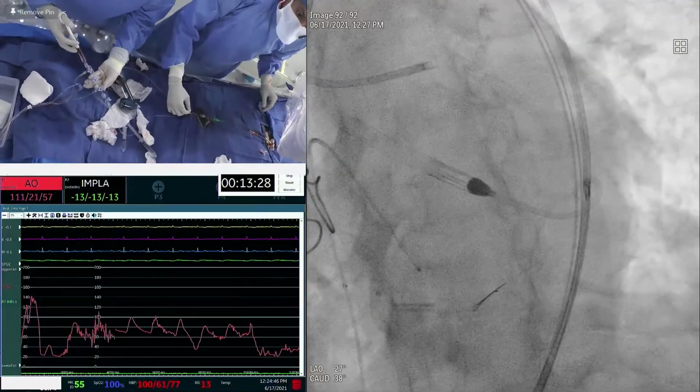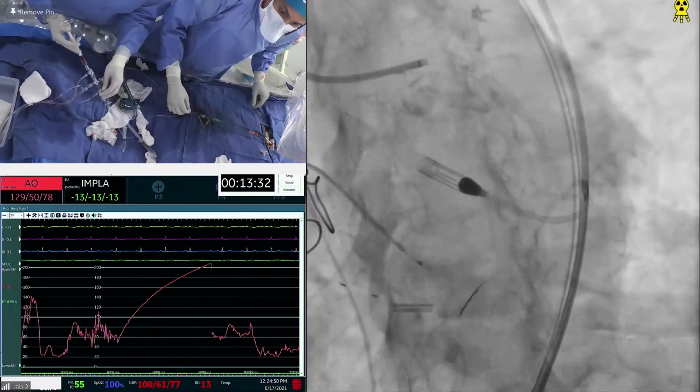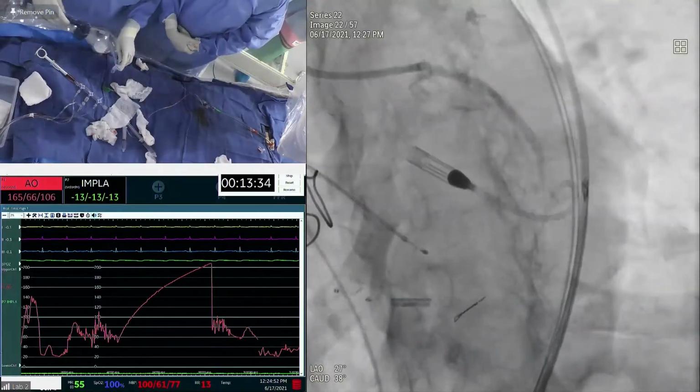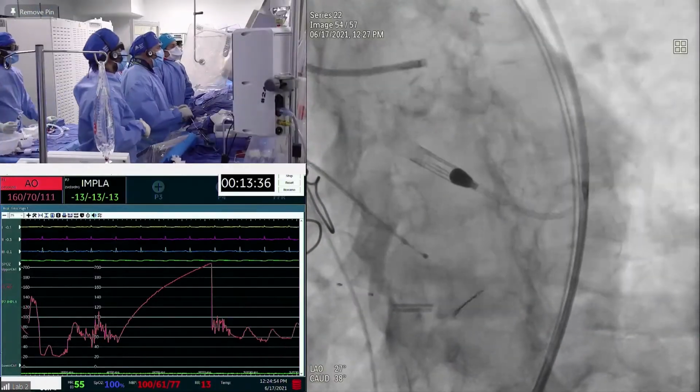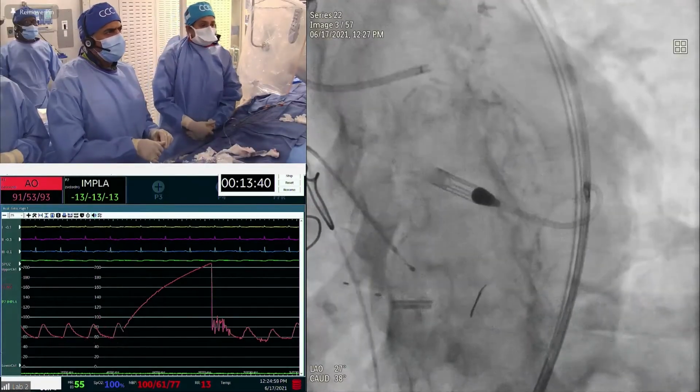I don't know. Okay. The moment of truth. Yeah. All right. Wow. I think very good. Excellent. The rest will become a little simpler. We'll be ready for the other side. Well, we will put a 12 millimeter 3.5 coming into the left main, and post dilate everything.